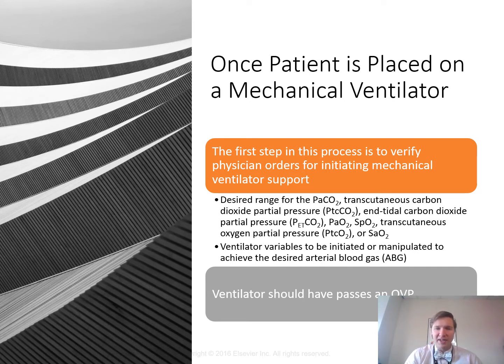So one of the things that we'll look at there is making sure that we're appropriately supporting the patient, especially per either mechanical ventilation guidelines by the respiratory therapy department or the physician's orders. We've got to look at the desired range for the PaCO2.